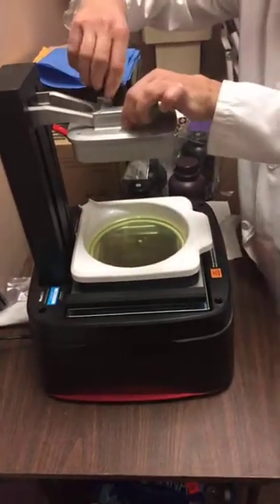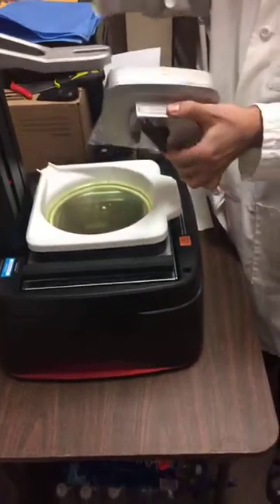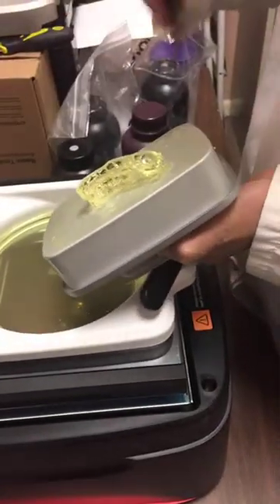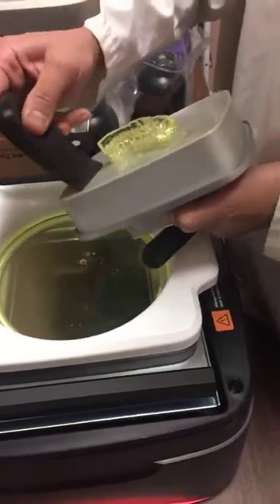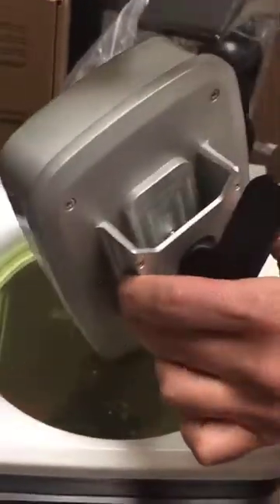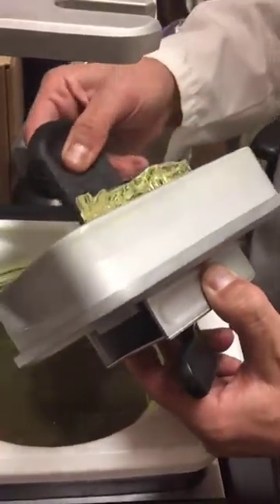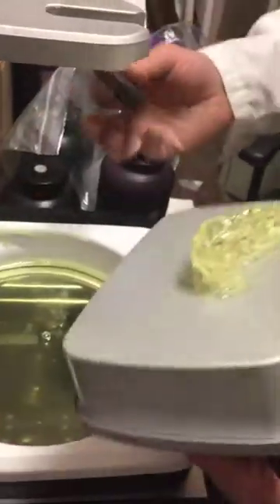So this is our first surgical guide. Print it out. I'm going to take the excess off. I have a Moonray 3D printer. You want to try to take the excess off because you don't want to waste too much of the material.